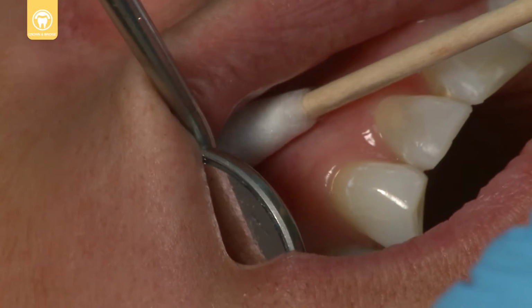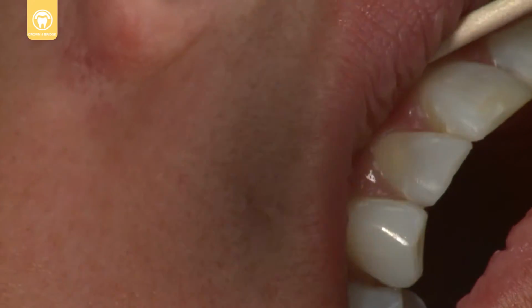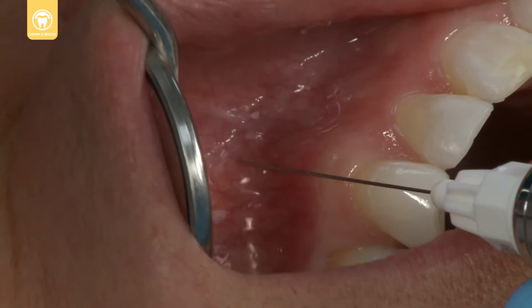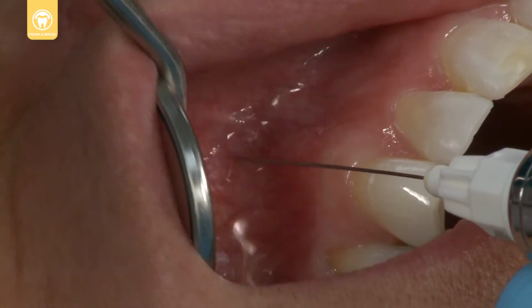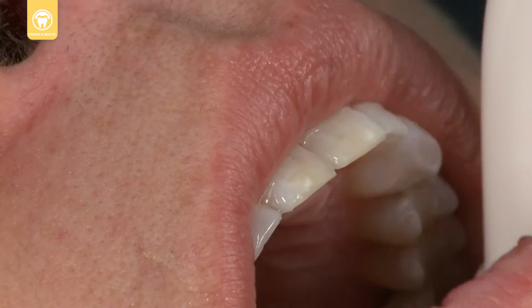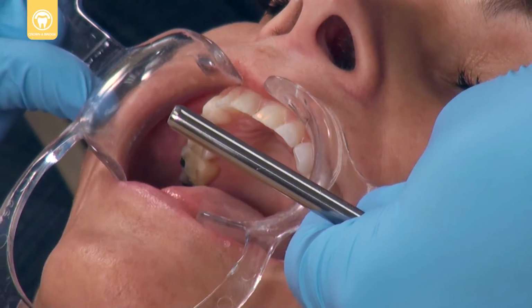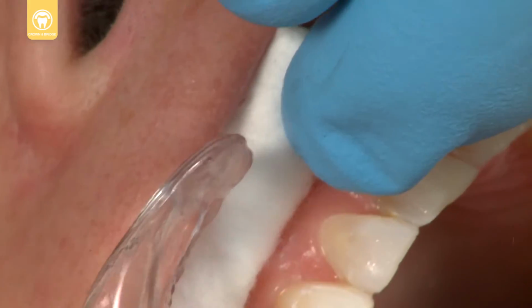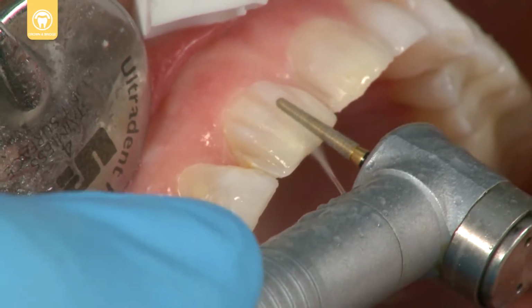Place Ultra Care topical anesthetic and anesthetize. Rinse and vacuum before isolating the preparation. Cut the veneer preparation.